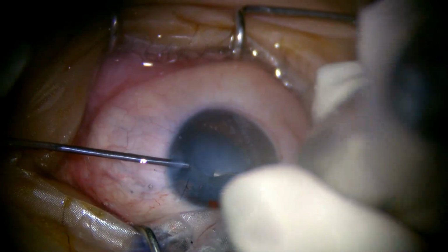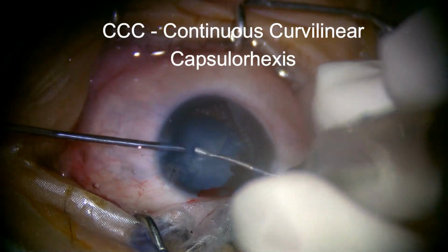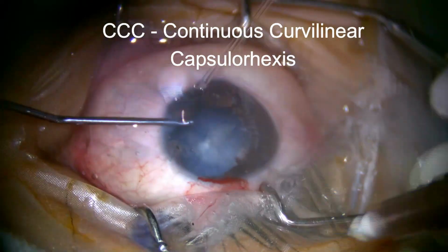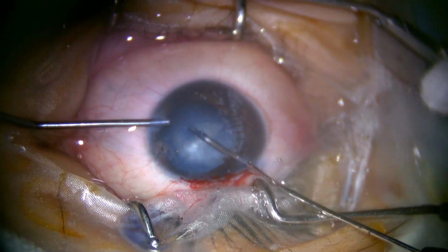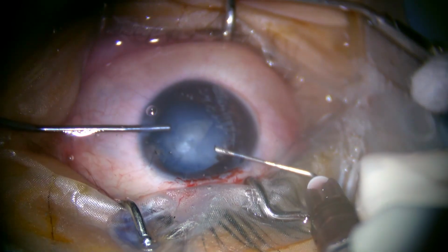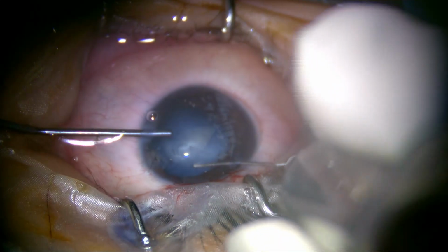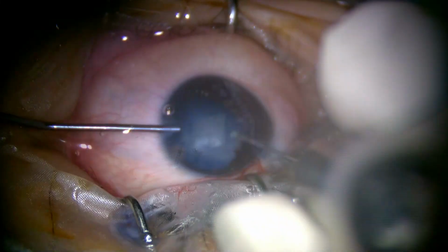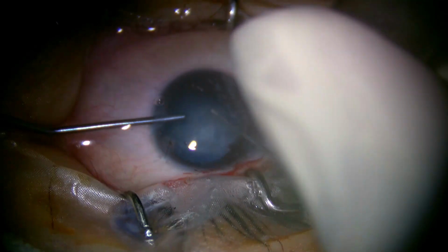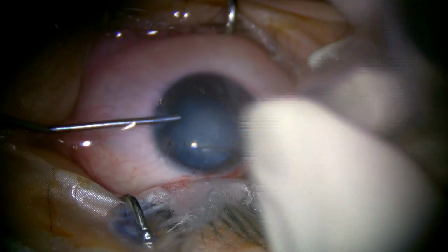Continuous curvilinear capsular rhexis is performed using cystitome needle, and here extension of the rhexis margin is noted. So the measures were taken to prevent the extension of rhexis margin posteriorly and for the successful completion of the continuous curvilinear capsular rhexis for intraocular lens placement in the capsular bag.